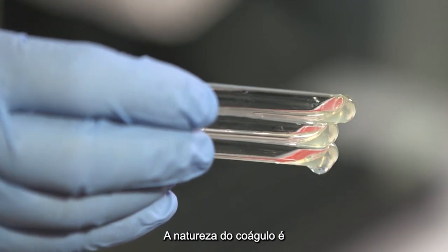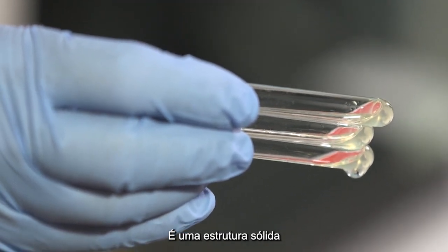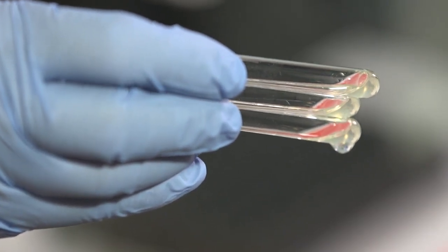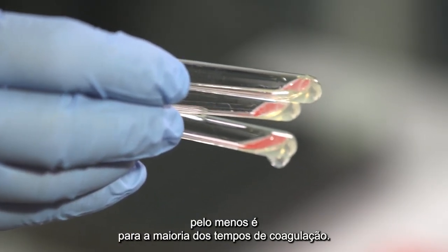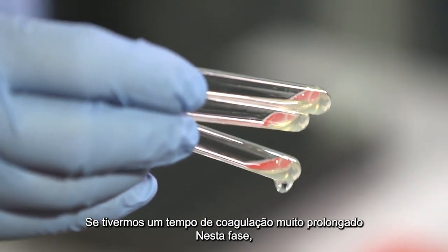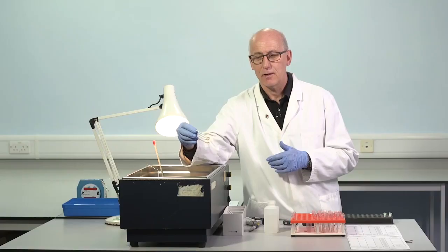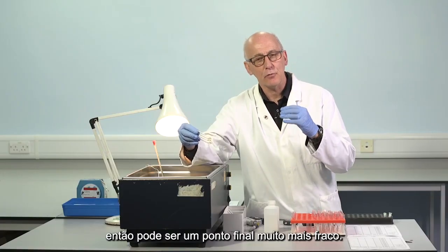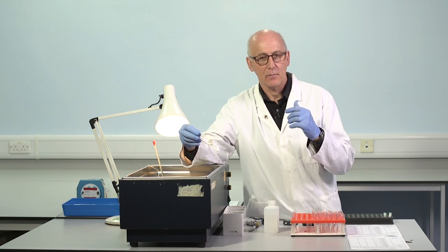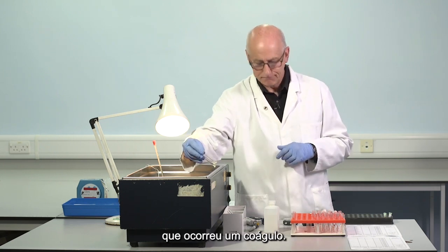The nature of the clot is really quite obvious. It's a solid structure, at least it is for most of the clotting times. If we have a very prolonged clotting time at this stage, up to 120, 130, 140 seconds, then it can be a much weaker endpoint. But even then, I think it's clear that a clot has occurred.